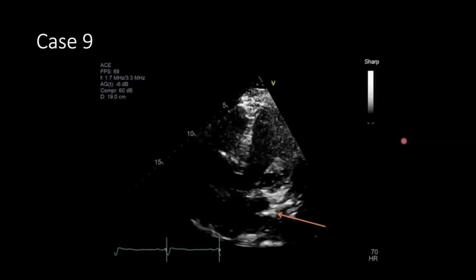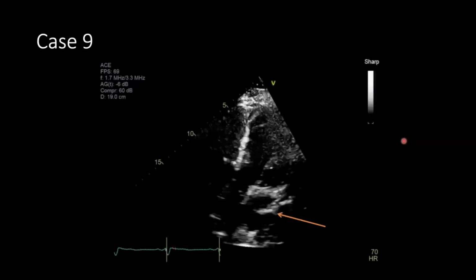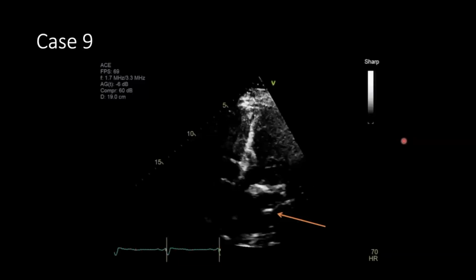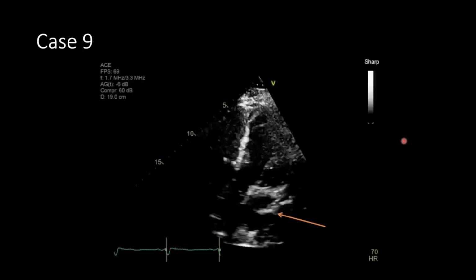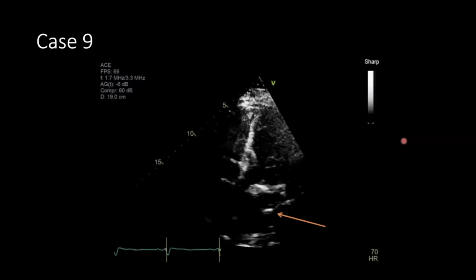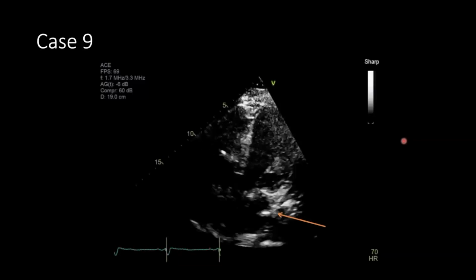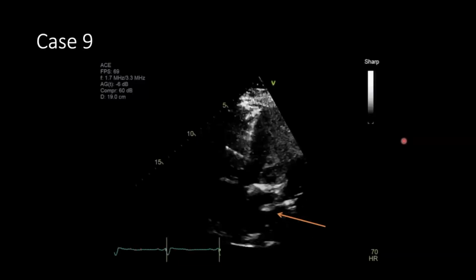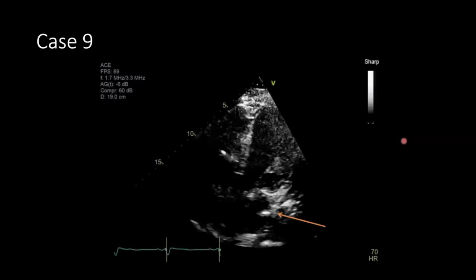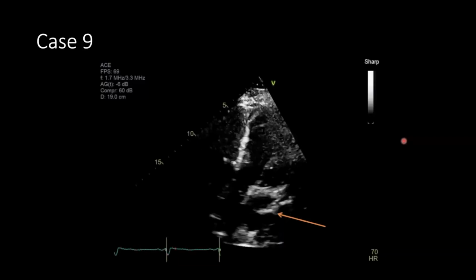The development of this valve is also very interesting. Two names are involved: one is a physician, the other one is an engineer. So they got together and came up with one of the first valves that could actually work for a long time. Some of the patients that we follow lasted for at least 35 years. Yes. The names: one is Starr, one is Edwards. Yep. The surgeon was Albert Starr.